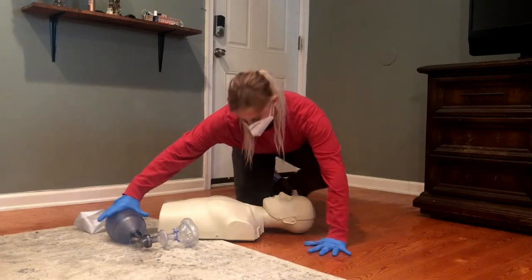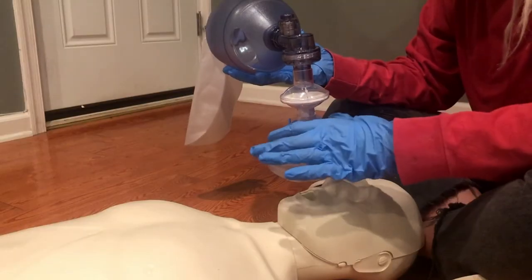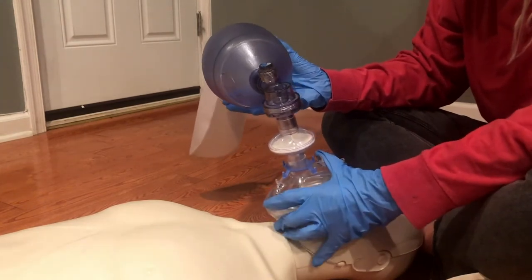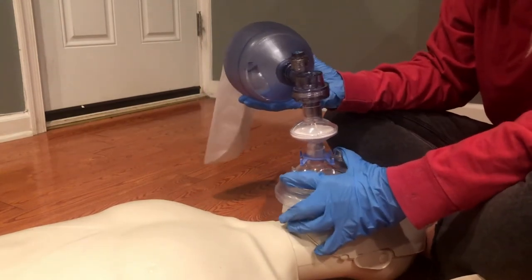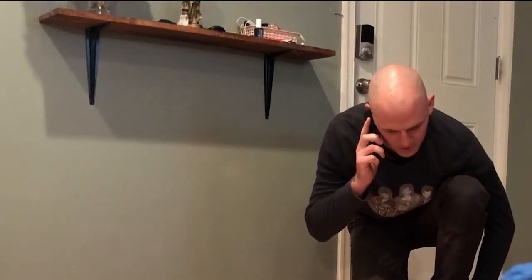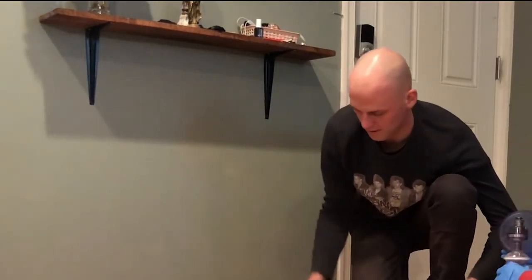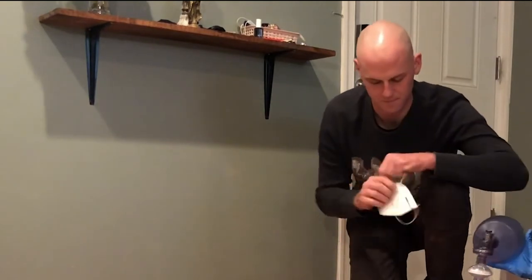In the two-person technique, the more experienced operator handles the mask because maintaining a proper mask seal is the most difficult task. The first responder can begin using the bag valve mask while the other person calls 911 and gives Narcan. Make sure both of you are wearing an N95 mask if possible.